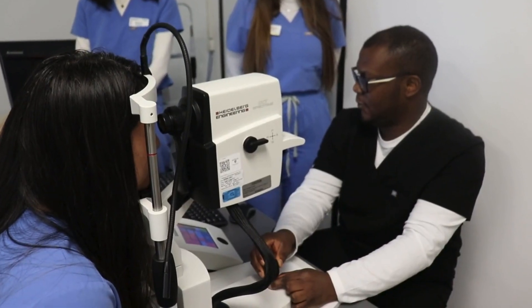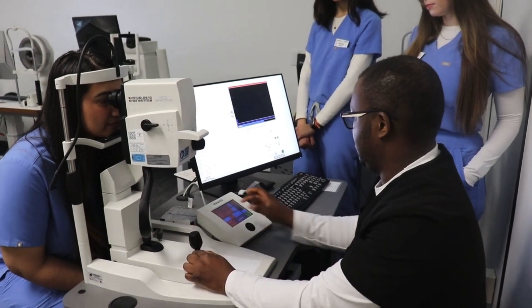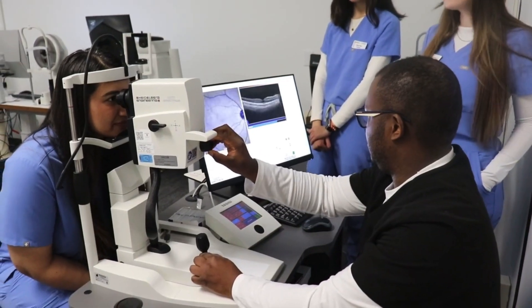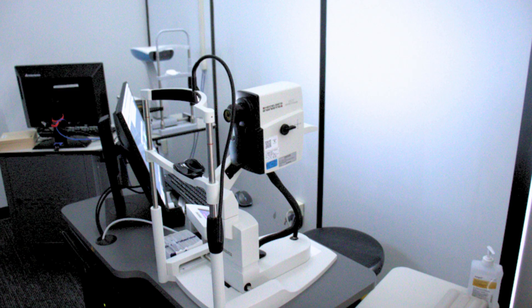The OCT is a very non-invasive test. It's similar to a fundus photograph that patients might be aware of, but there's no flash of light. It's really just putting your head into the instrument and focusing on a target. The target might move, in which case the patient would be asked to look where it moves, but it doesn't touch the eye. There's no pain and no bright light, so it's a very comfortable, easy test — done within seconds.